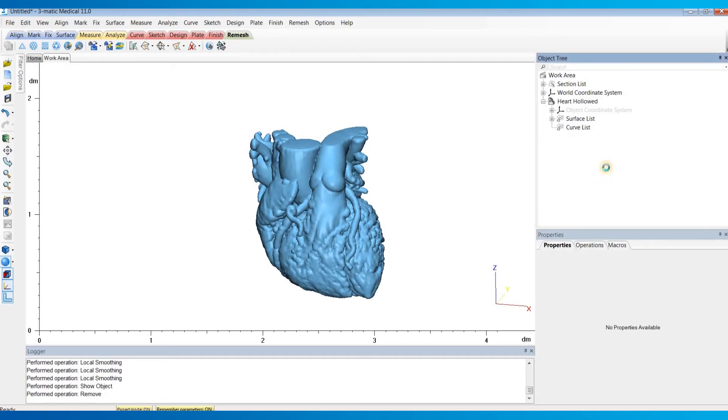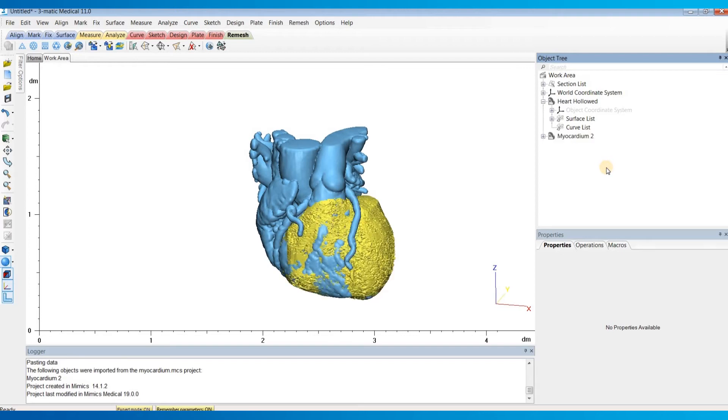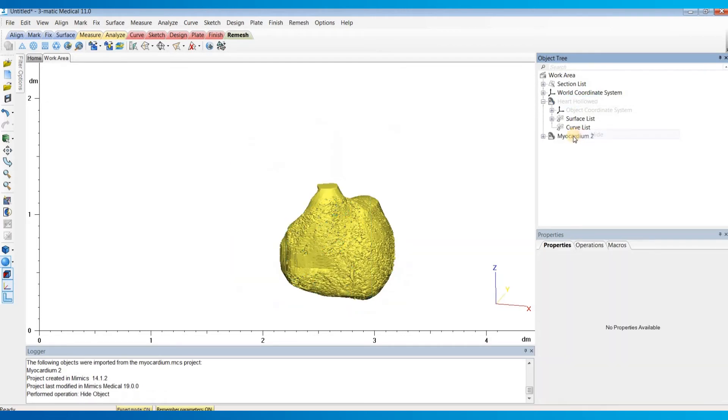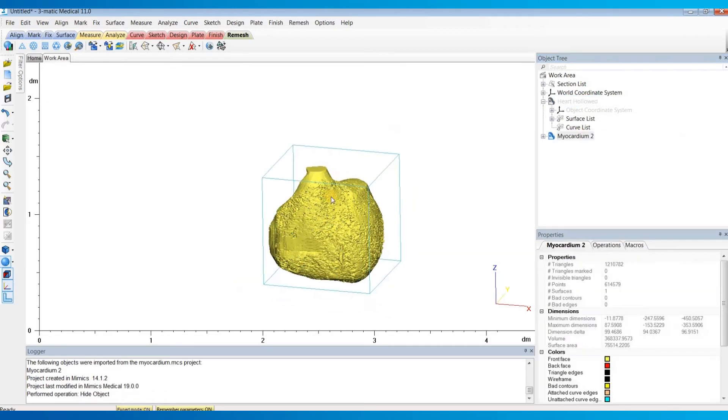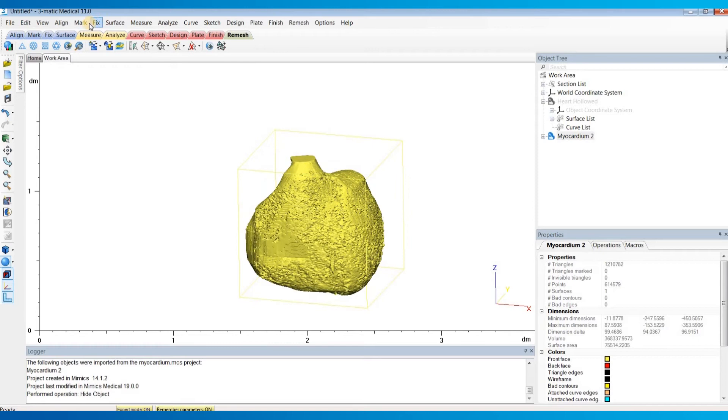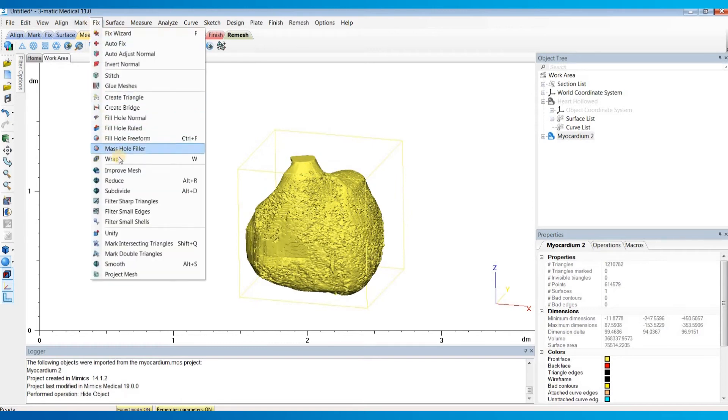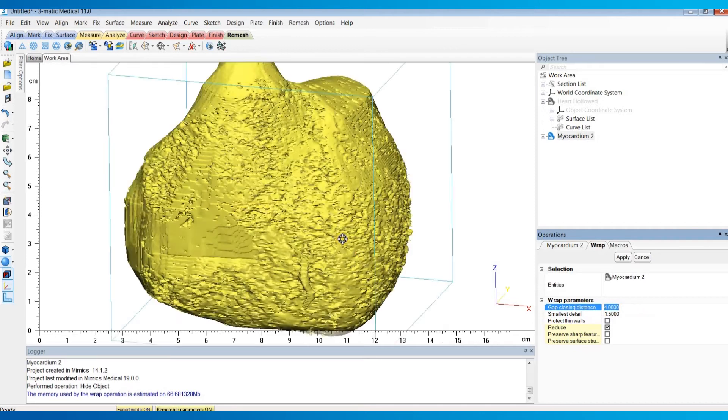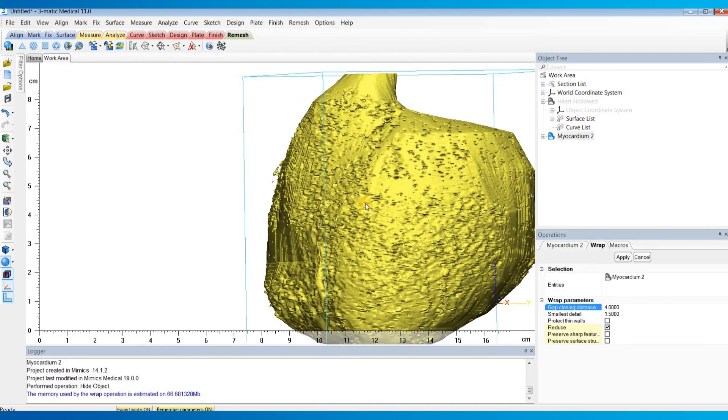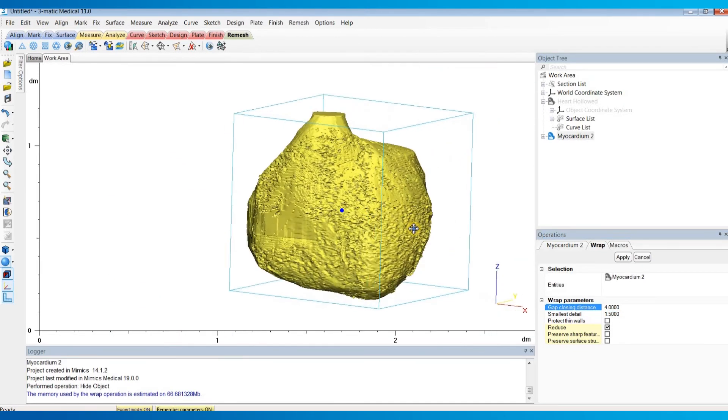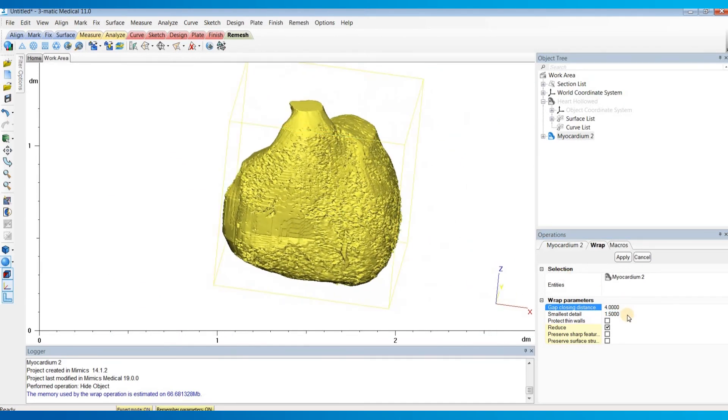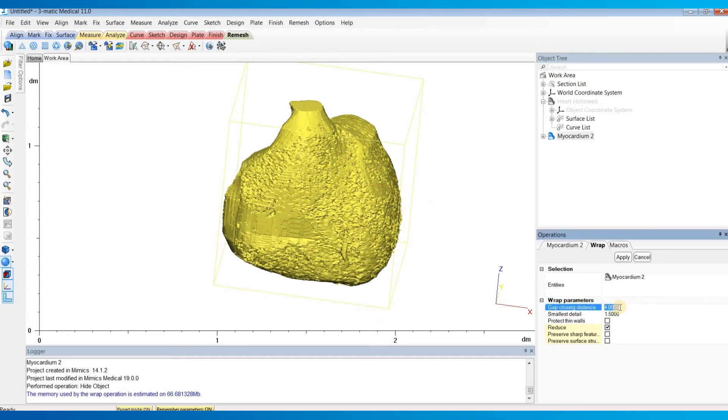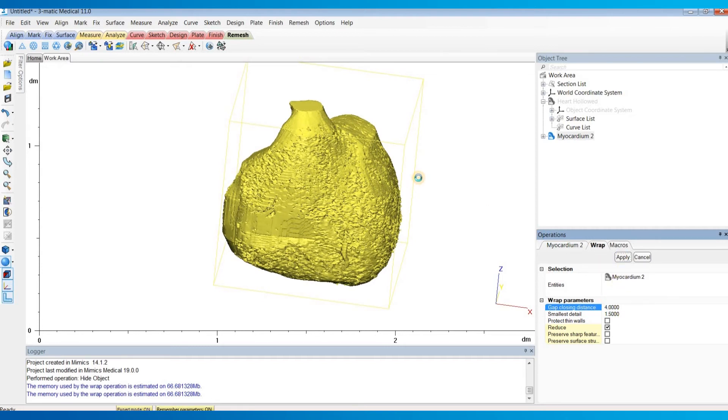Then hit Ctrl+V in 3Matic to paste it in. Now the first thing I'll typically do is under the fixed menu, I'll do a wrap. I'm going to set a pretty large gap closing distance to fill in all of these holes on the surface of our myocardium, as well as a pretty large smallest detail to get a really smooth surface. So I'm going to use 4mm for the gap closing distance and 1.5mm for the smallest detail.